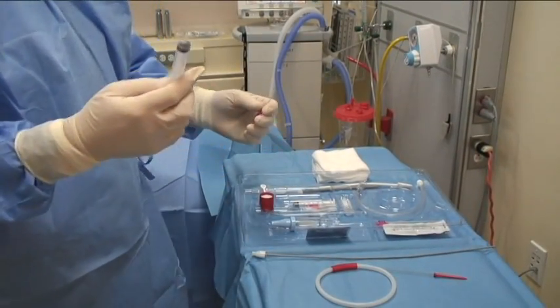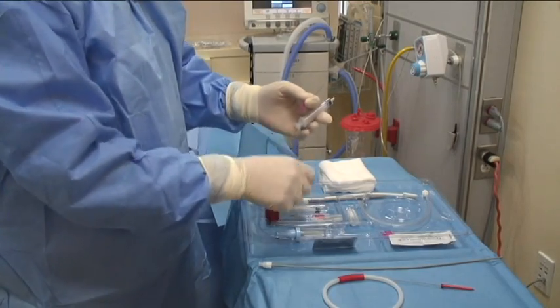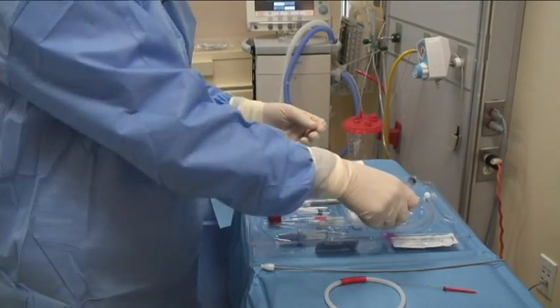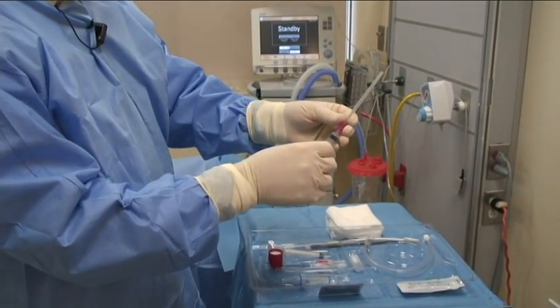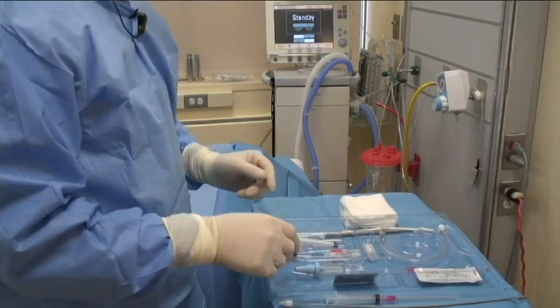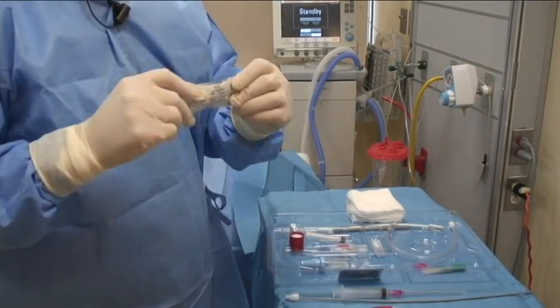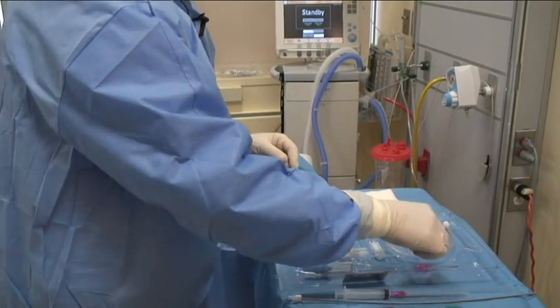The kit has a couple syringes. It has a 5cc syringe and a 3cc syringe. The 5cc syringe we will use for the procedure, and I can use one of two needles. There's a longer needle and a shorter needle. I'll just put this ready here to use and lay it down. In the kit also, there's some sutures for when we're finished. There's a blade for making a small incision, and again, this other needle.